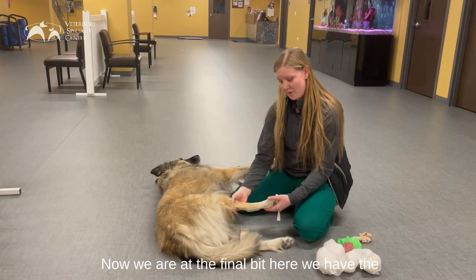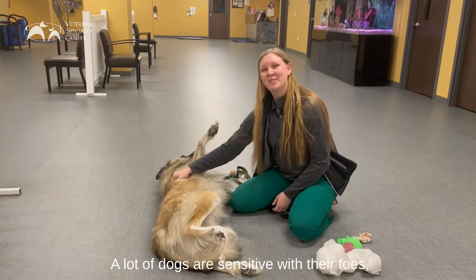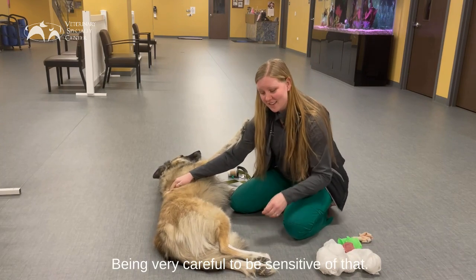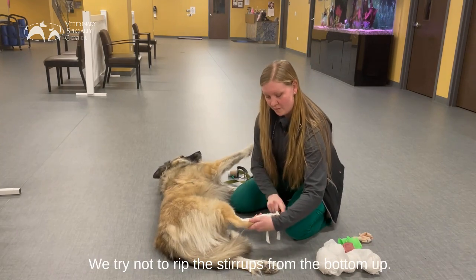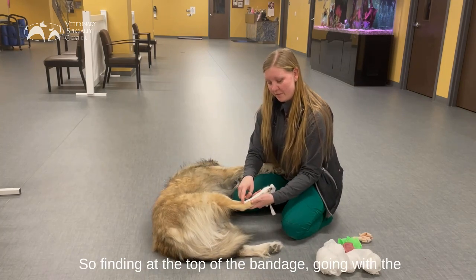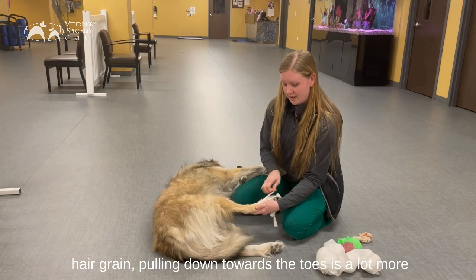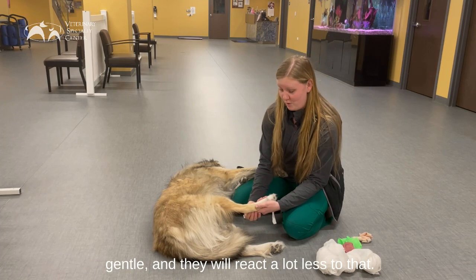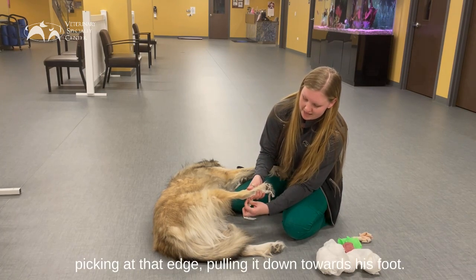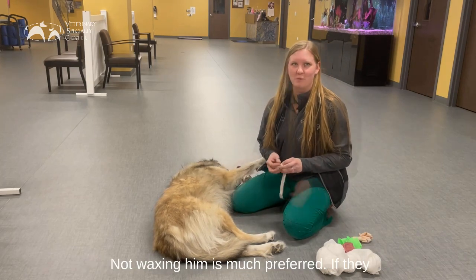Now we are at the final bit here. We have the remaining bit of the tape stirrups that we talked about earlier. A lot of dogs are sensitive with their toes, so they might not like this part — be very careful to be sensitive of that. We try not to rip the stirrups from the bottom up, as that is going to wax him and that is uncomfortable. So finding the top of the bandage, going with the hair grain, and pulling down towards the toes is a lot more gentle and they will react a lot less. There is one on the inside of the leg too — pick at that edge and pull it down towards the foot rather than waxing him.